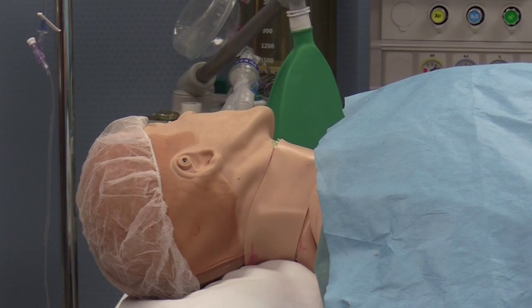For a blind insertion technique, which is being demonstrated here, you would begin with a physical assessment of the patient and identification of the landmarks. With the patient's head turned slightly in the opposite direction, you would assess for the triangle that exists on the patient's neck, midsection between the sternal notch and the mastoid process. It's also important to place the patient in the Trendelenburg position to prevent entrainment of air into the venous system during cannulation.